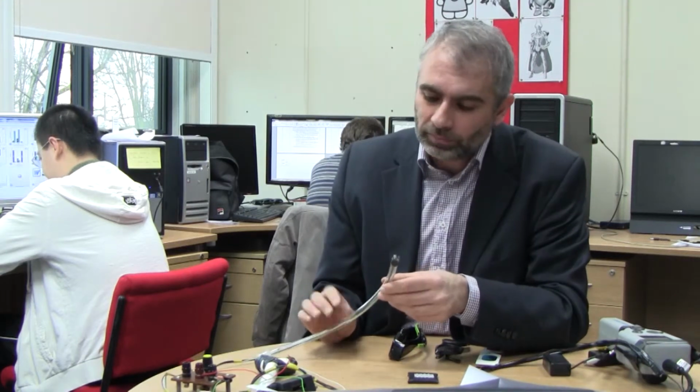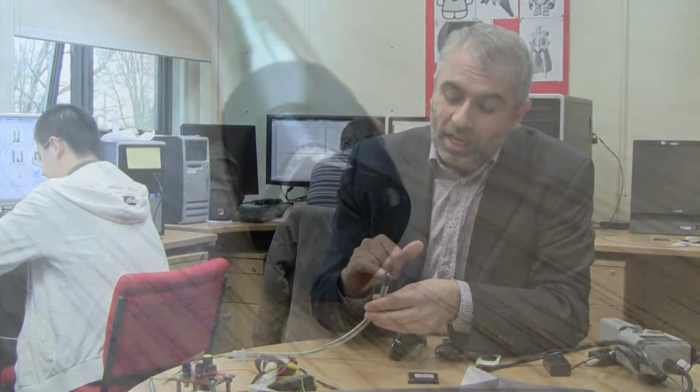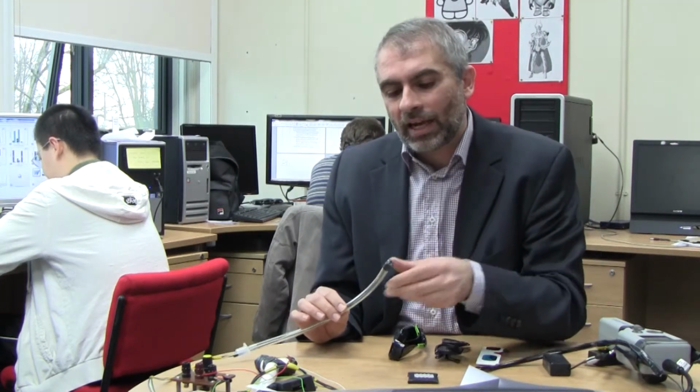Later on, we progressed to a more advanced prototype number 2, where we used a more medical device and a much smaller camera. We used what was the smallest camera available on the market, 3mm, which we can use for processing, and 1 LED. We tried this again with the mannequin, and this time we wanted to process the images. Our focus was on image processing, trying to get depth maps, because our more advanced phase of experimentation is to use augmented reality, so that the surgeon, when operating, sees the video in 3D of the remote environment, but can also see some graphical elements added.